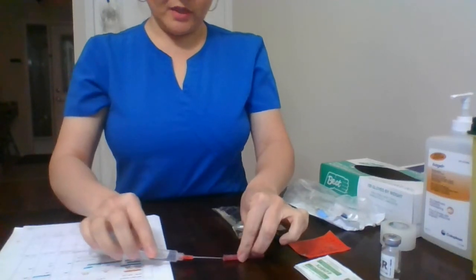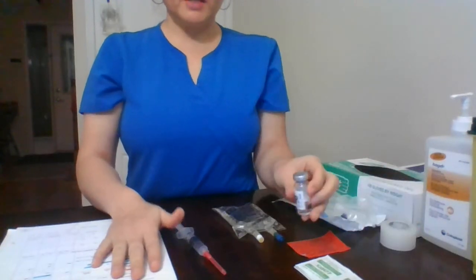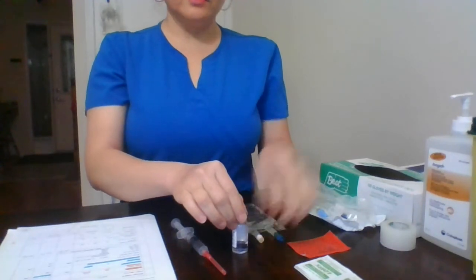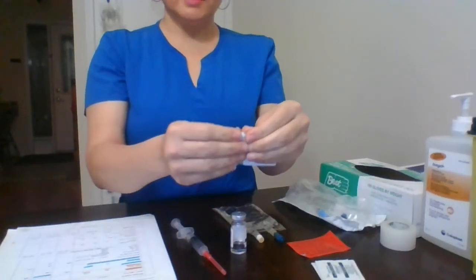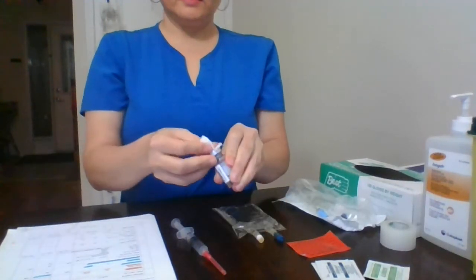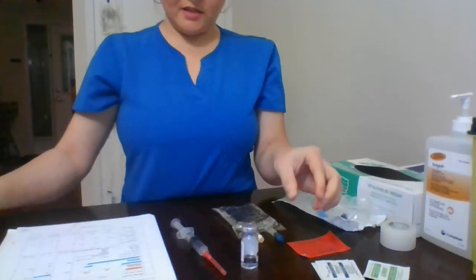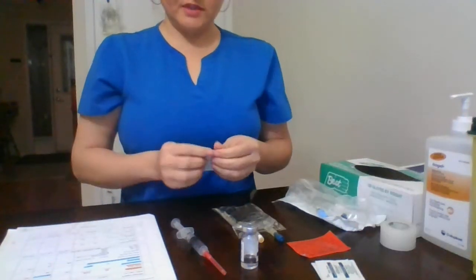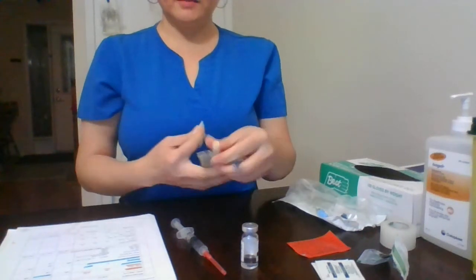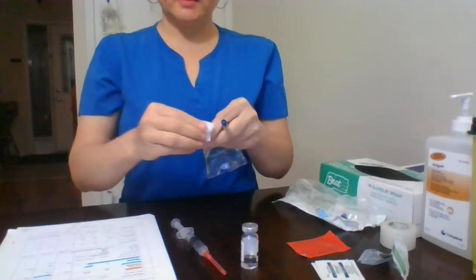Since I haven't wiped, one thing I forgot to mention is because this vial was already used, what I needed to do is to take an alcohol pad and wipe, which I should have done before, but I know that I'm supposed to do that. And then the next thing I will do is to wipe our mini bag where we're supposed to inject the medication.